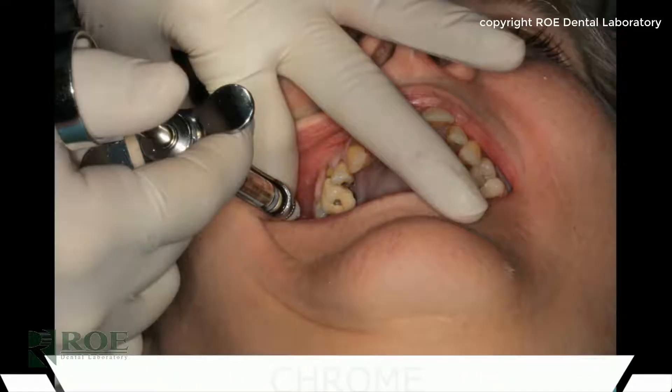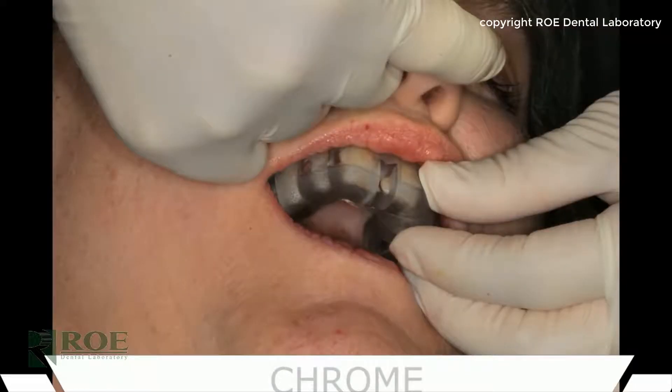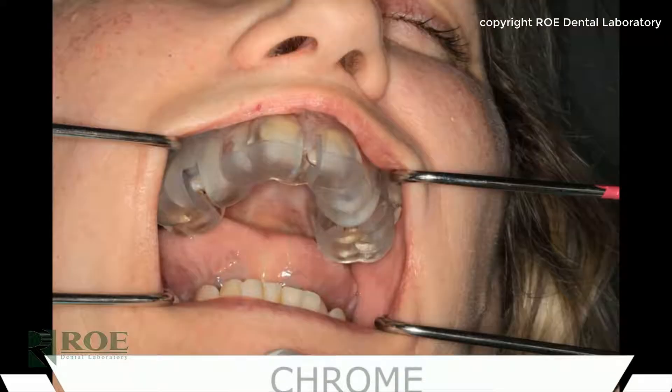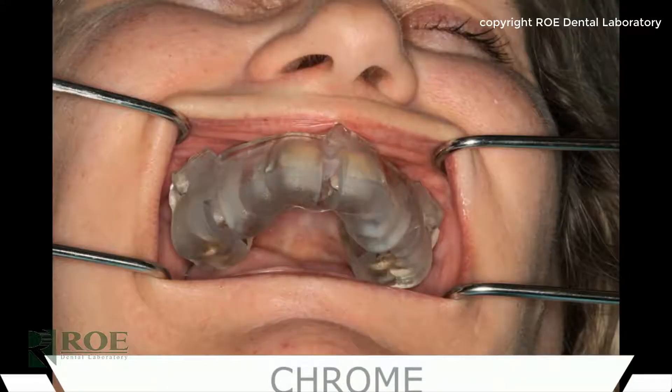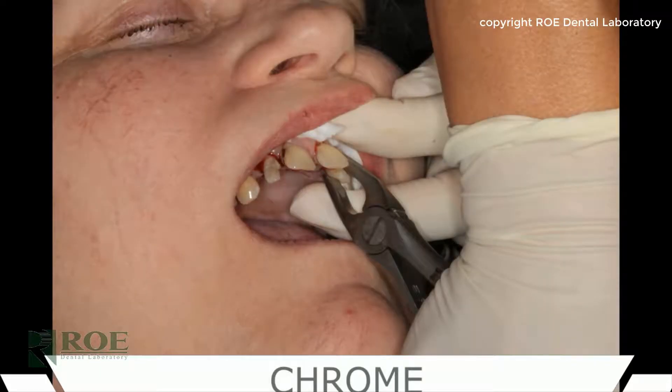Let's begin the case. The first step is to anesthetize the patient, and then the pin guide is tried in. This is a dentate case, so the pin guide will rest on teeth. There are occlusal windows designed in the pin guide to ensure the teeth and pin guide meet perfectly. The windows are exposed so you can make a visual confirmation that the pin guide is 100% seated.